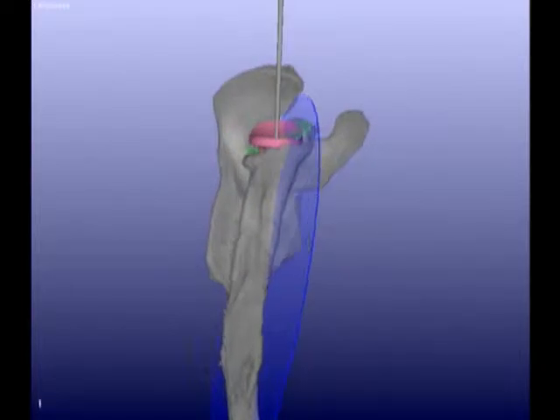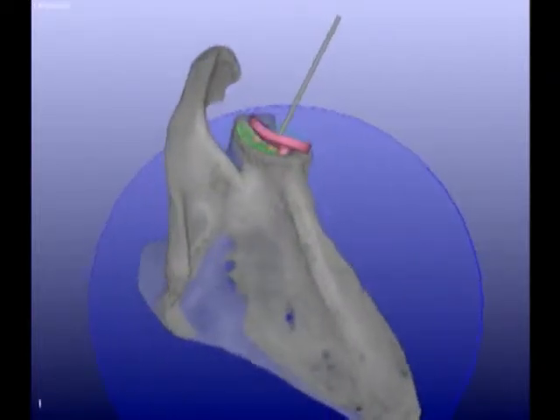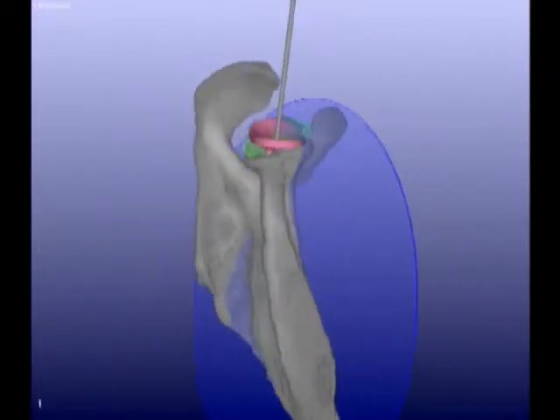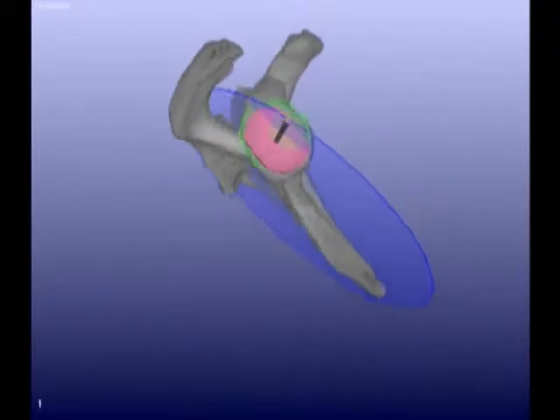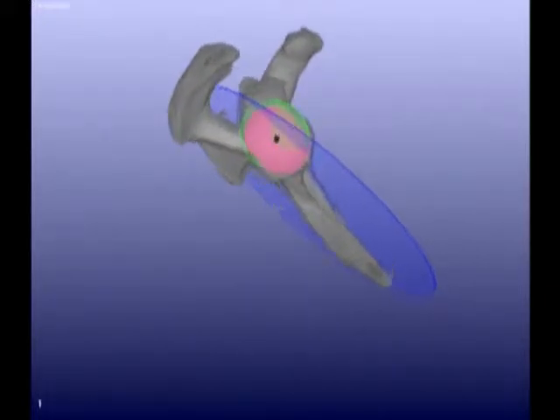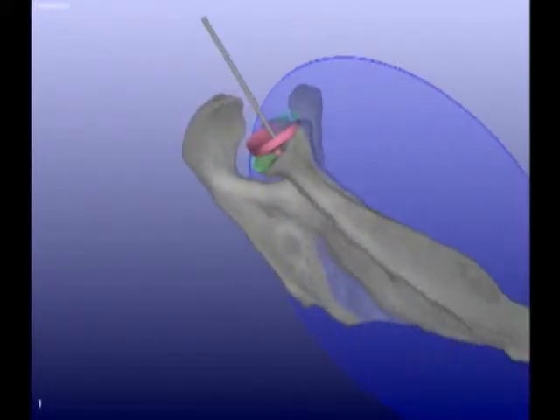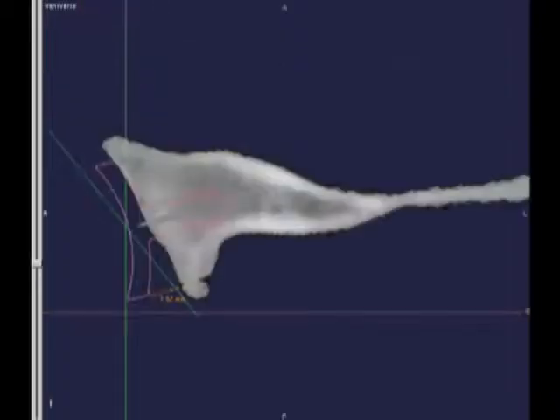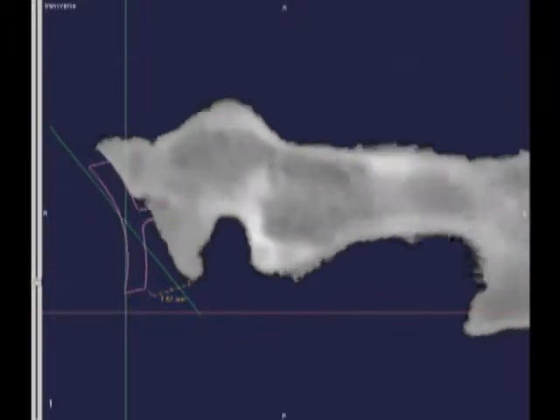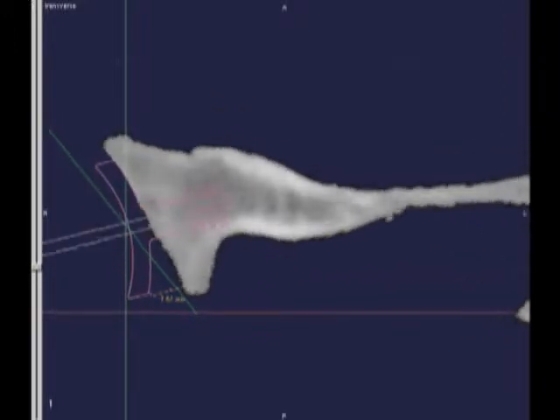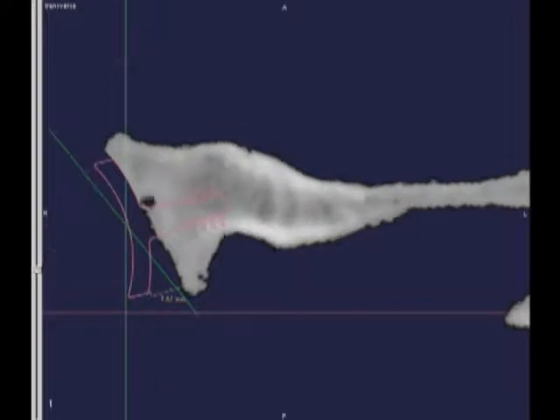This case represents a patient with osteoarthritis of the shoulder having about 28 to 30 degrees of glenoid retroversion with posterior glenoid bone loss. The implant is placed, as you can see, in a corrected version with about 8 millimeters of bone for grafting.